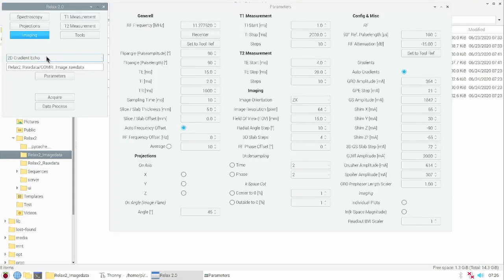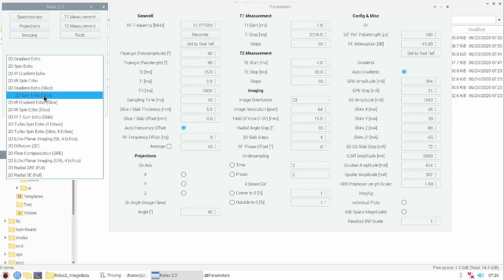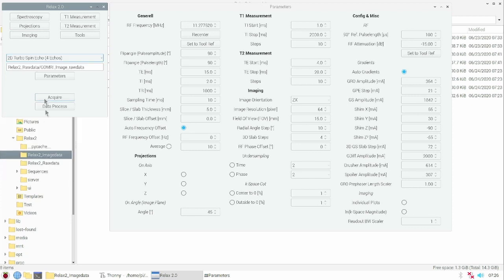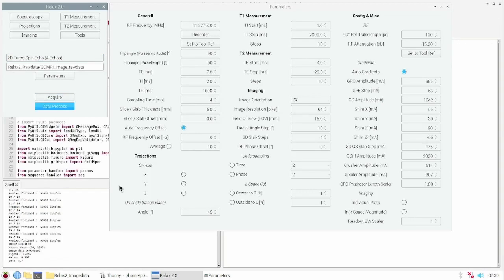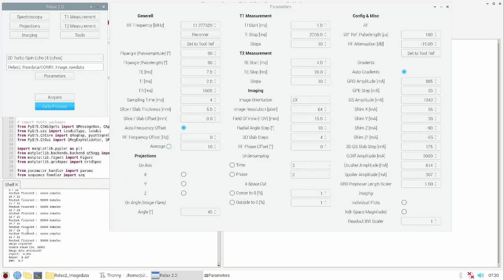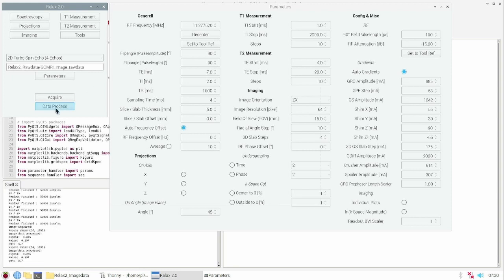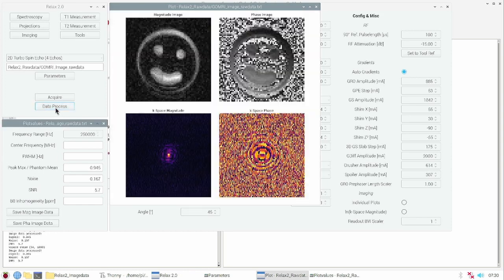Let's do another image sequence. I choose the turbospin echo sequence with 4 echoes and click acquire. With its 4 echoes, the turbospin echo only needs 16 acquirements instead of 64 like the normal spin echo sequence. This is much faster. After the acquisition I can click on data process to get the image of the new sample.